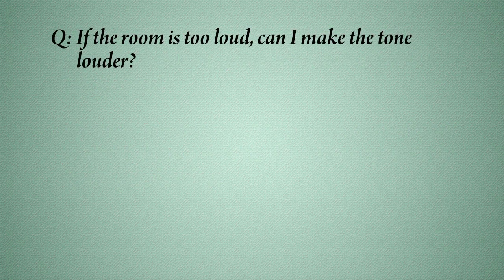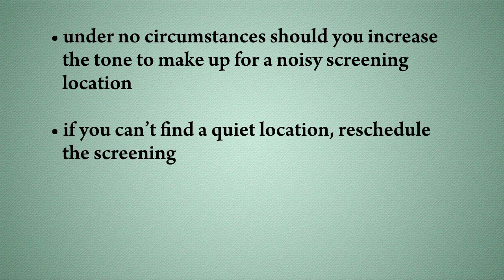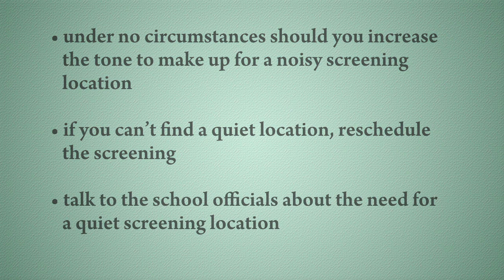If the room is too loud, can I make the tone louder? No, under no circumstances should you increase the tone to make up for a noisy screening location. If you cannot find a quiet screening room, reschedule the screening and talk to the school officials about the need for a quiet screening location.